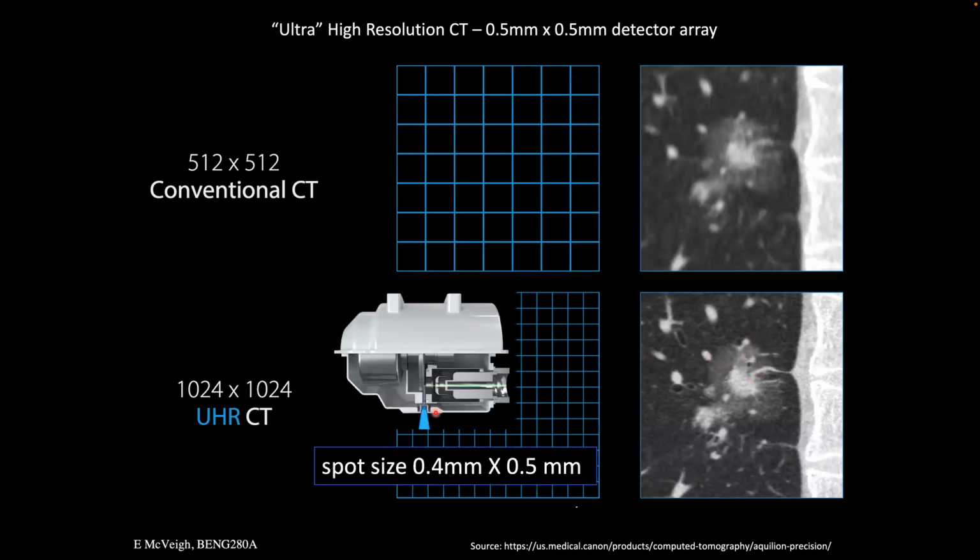One of the caveats, though, is in order to get these, you need to reduce your spot size on your X-ray tube down to at least sort of this size, right? And so now we've got 1/4 of the rectangle trying to make the same number of x-rays, right? In fact, maybe make more x-rays because we need to measure them in these pixels, right?